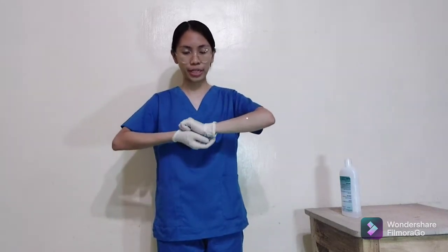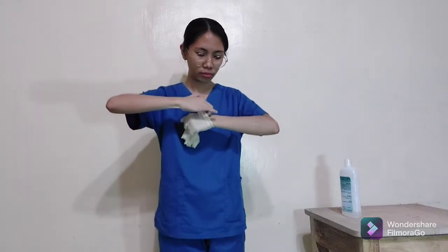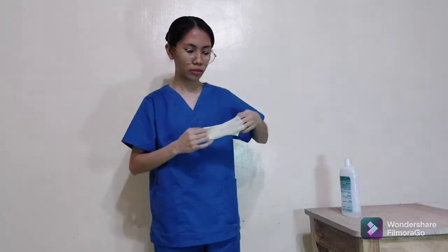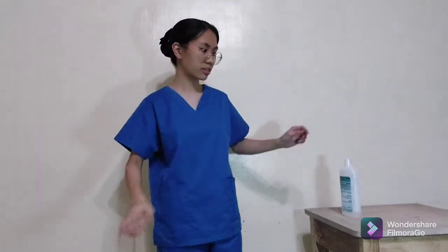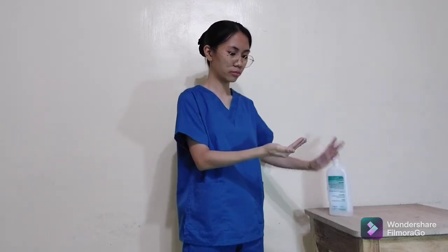Remove gloves and perform hand hygiene. This prevents the transmission of microorganisms. So let's discard it, then use alcohol.